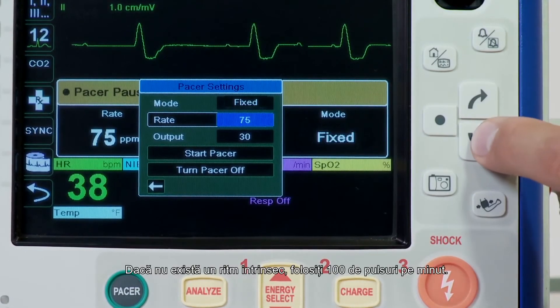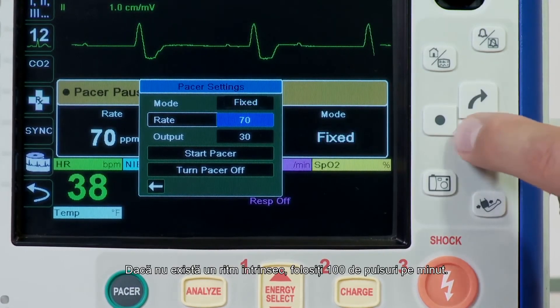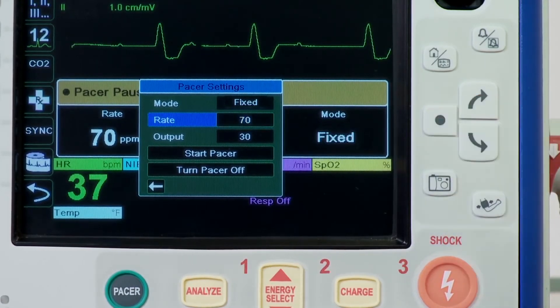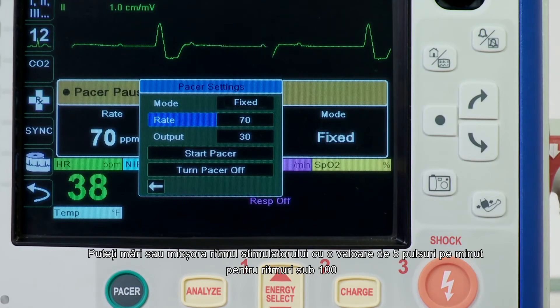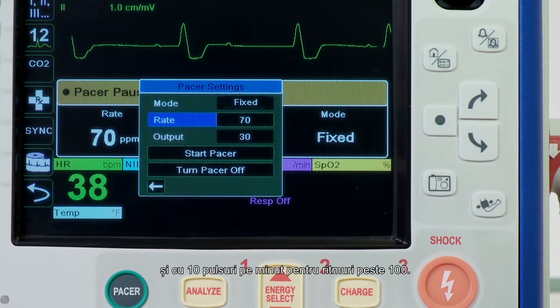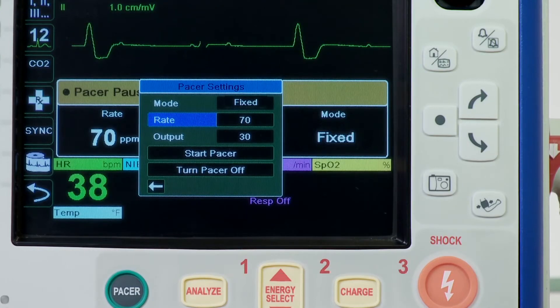If no intrinsic rate exists, use 100 paces per minute. You can increase or decrease the pacer rate by a value of 5 paces per minute for rates below 100, and 10 paces per minute for rates above 100.